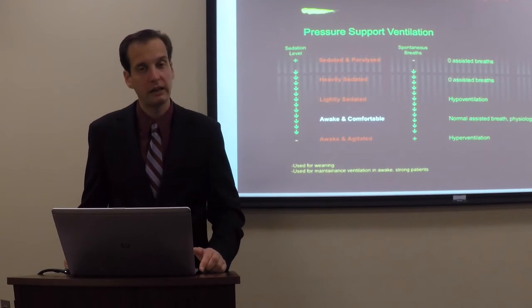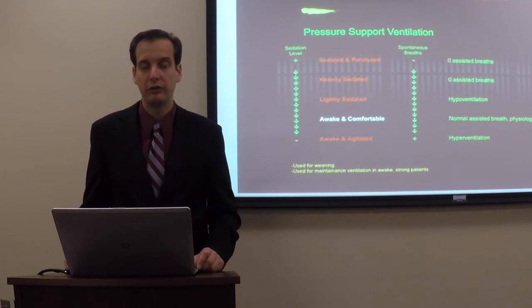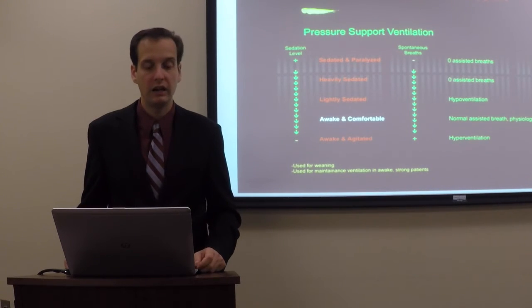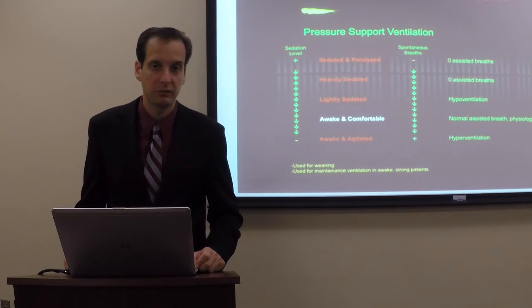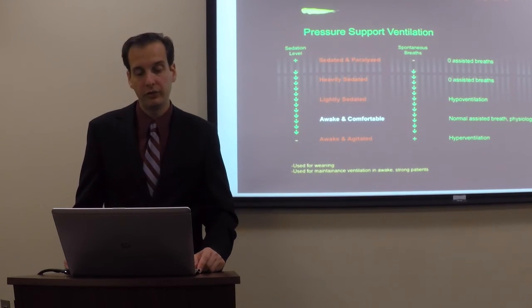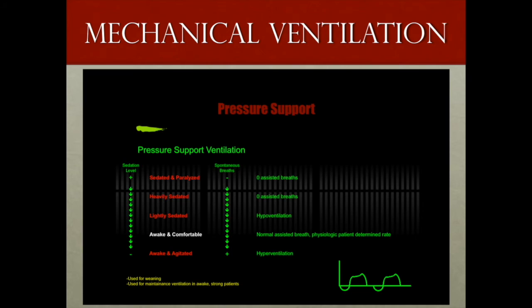Again, if you are awake and agitated, you will hyperventilate. However, you will not hyperventilate to the same degree as if you were receiving a volume cycle or a time cycle pressure limited breath type. Pressure support is good for weaning and is good for long-term weaning, and it is also used for maintenance of patients who are awake, alert, comfortable, and strong on the ventilator.